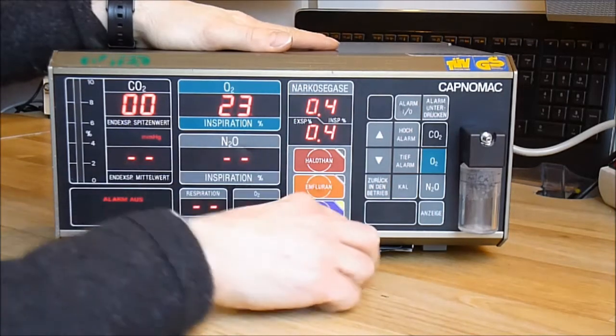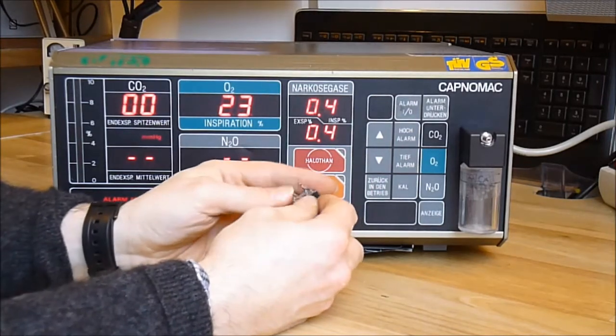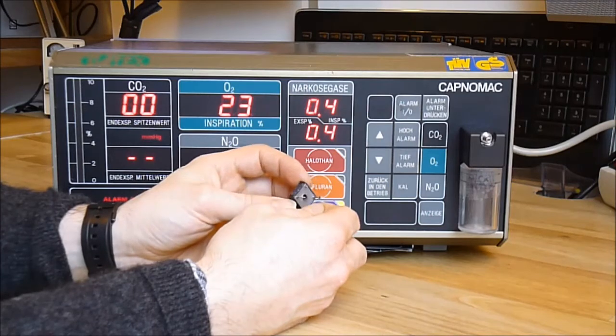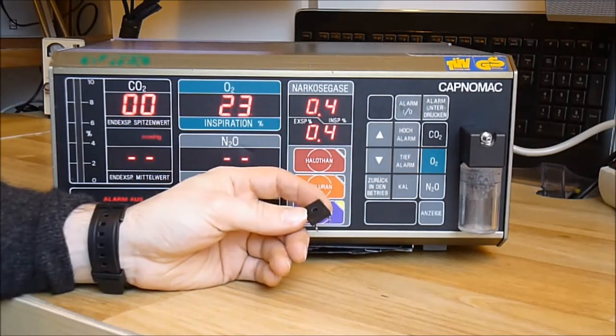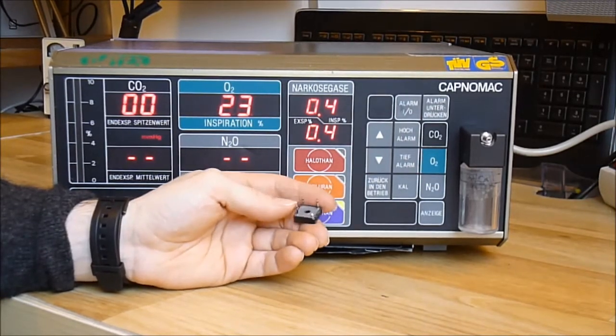I found the faulty plate in the power supply. The bridge rectifier was in short circuit between two pins. Oddly enough, I do not see what I did possibly do wrong in order to provoke this.